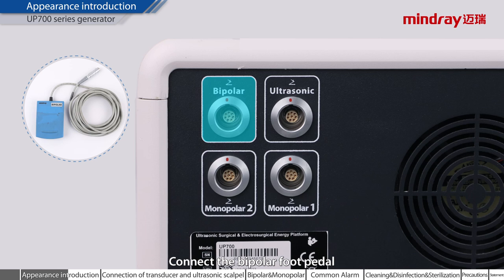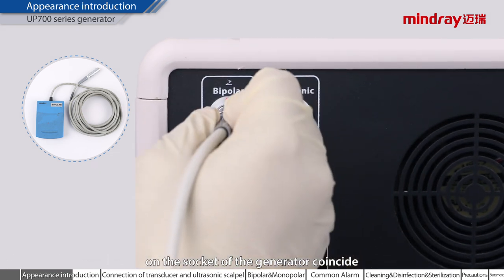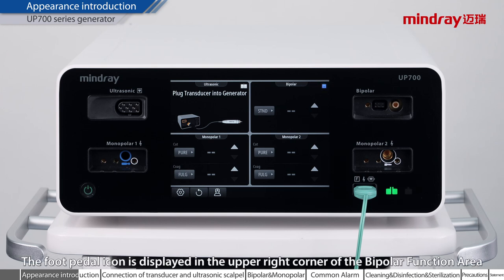Connect the bipolar foot pedal. When connecting, please make sure that the red mark on the cable of the bipolar foot pedal and the red mark on the socket of the generator coincide. After correct insertion, the bipolar function area displays that the foot switch has been plugged into the bipolar sockets. The foot pedal icon is displayed in the upper right corner of the bipolar function area.